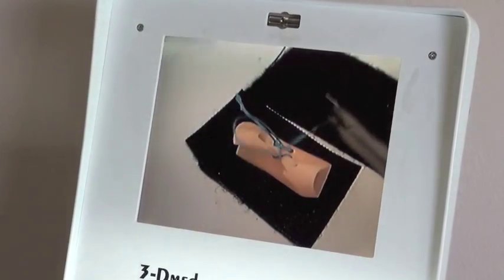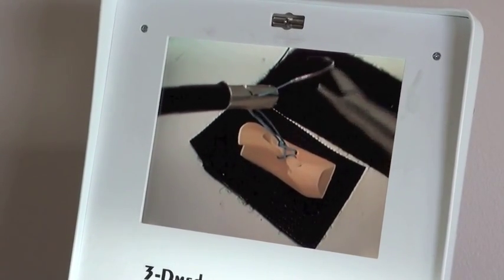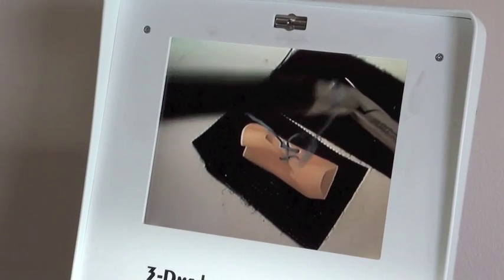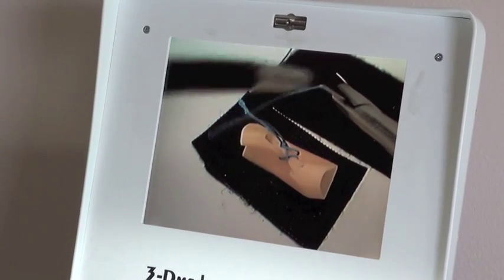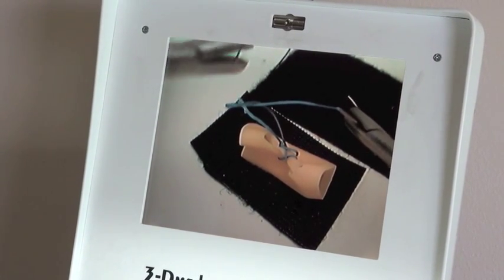So you don't want to do big movements like this. You want to do a tiny movement. So I've done my four ties. You want to do a tiny wrap right around the stiff area. And you want this line to be horizontal to the vaginal cuff. And that's it.